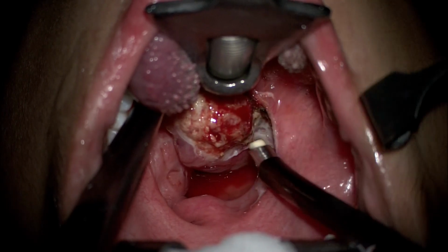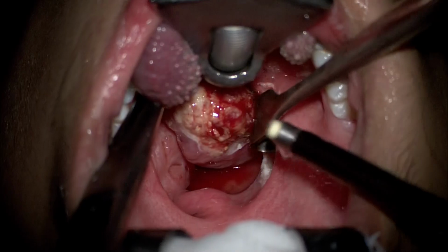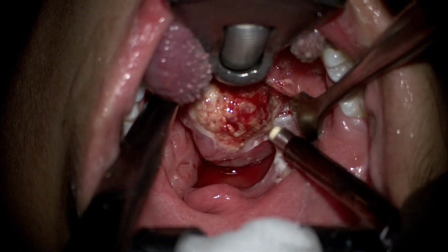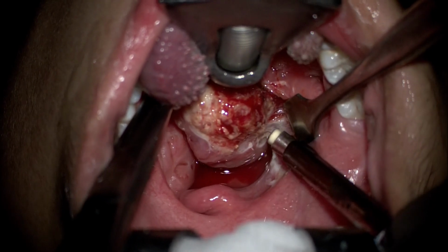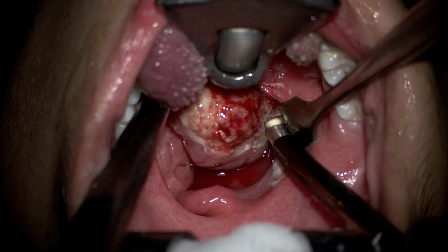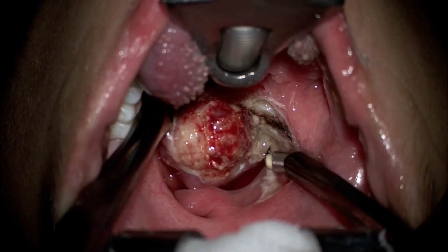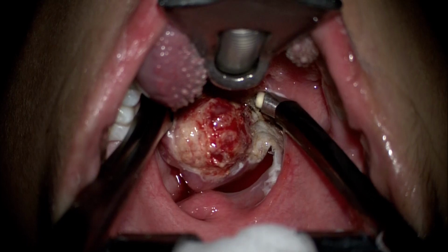Now, as we keep dissecting towards the lower part of the tonsil, that is where a slight amount of caution and patience is important. Here, one of the assistants can gently retract the anterior pillar laterally to be able to see if there is any small bleeder present, which can be taken care of before we proceed further inferiorly. The tonsillar artery or its branches often come at the inferior pole of the tonsil. So here one needs to be more judicious as well as patient in using the ablation and the coagulation modes turn by turn, so as to first coagulate along the surface and then ablate, so as to not cause any alarming hemorrhage from the tonsillar bed.